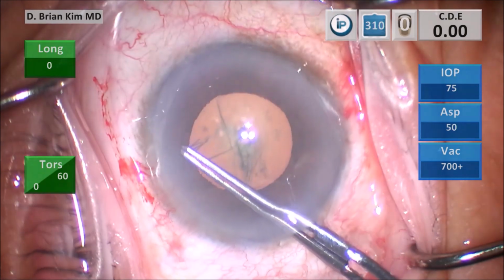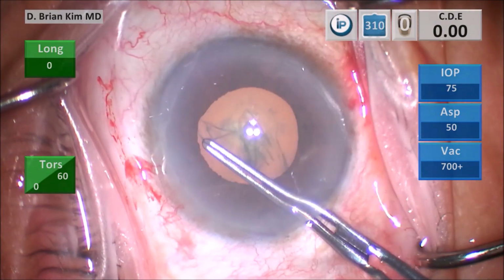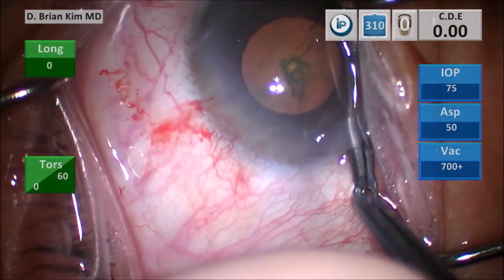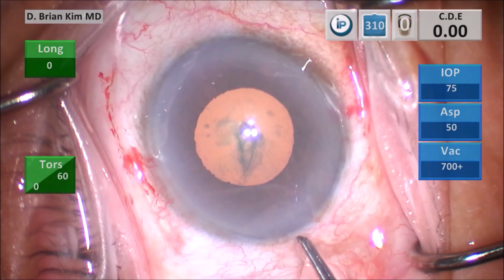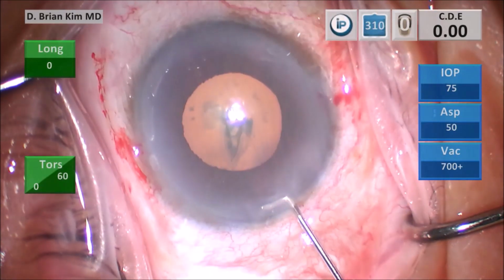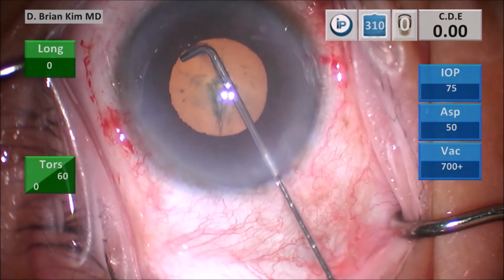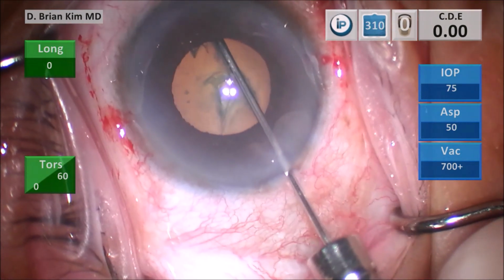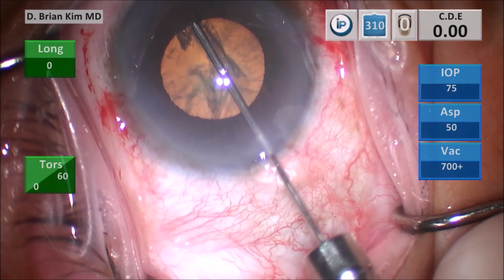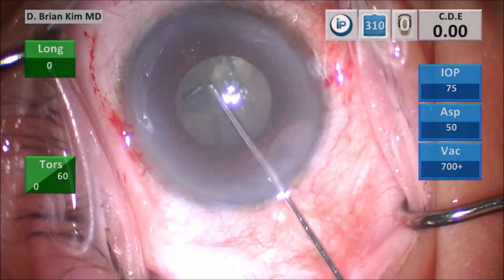I'm making sure I am not putting any pressure on the wound to minimize any viscoelastic egress, which can cause my rhexis to radialize. I burp some viscoelastic at the end to decompress the anterior chamber. I do my capsular fornix hydrodissection technique. I place the cannula out to the contralateral equator flat, and then I get into the capsular fornix, rotate the cannula tip down 90 degrees, and then I push the BSS and it flows. A nice hydrodissection wave propagates very nicely.